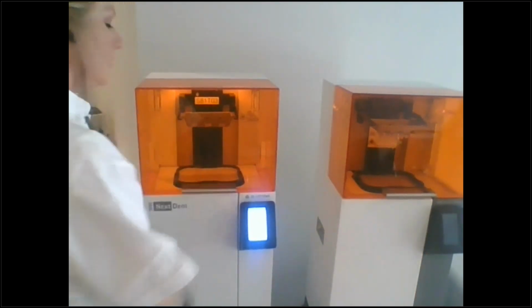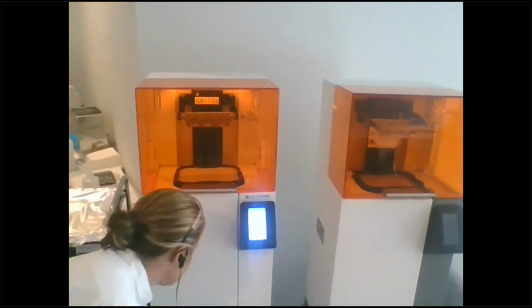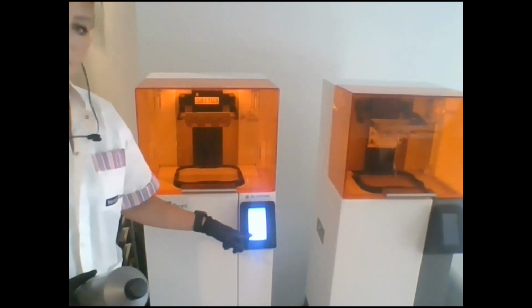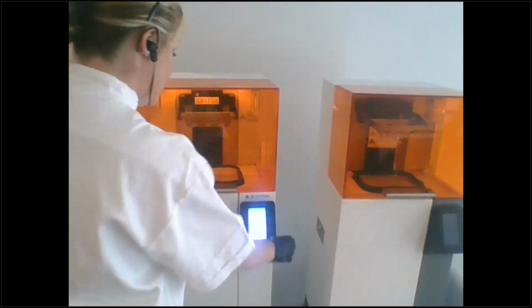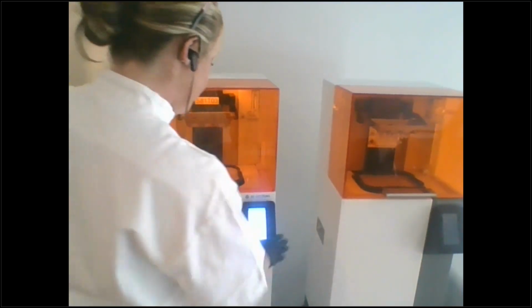And then just click your door shut and hit start job. And it'll tell you, hey, make sure that you put Model White in here. That's what you called for. So I hit continue and use the back barcode on there.